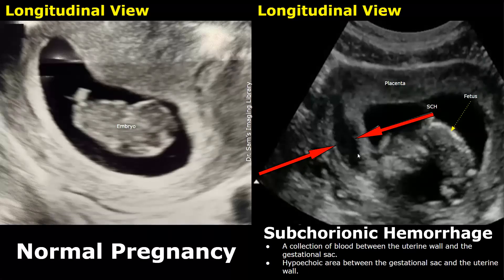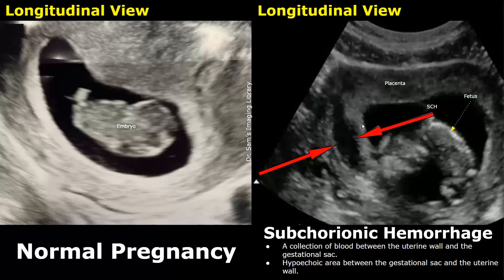You will see many cases of subchorionic hemorrhage which will help you in diagnosing such cases on ultrasound. We will be mainly focusing on the gestational sac appearance, so the gestational age of the embryo or fetus in both the images may not match.